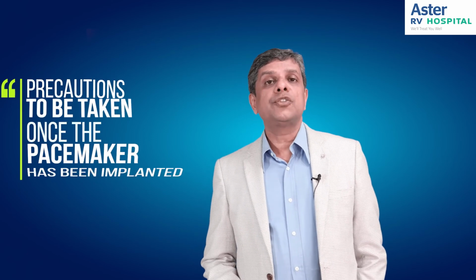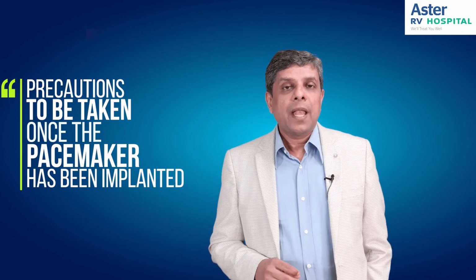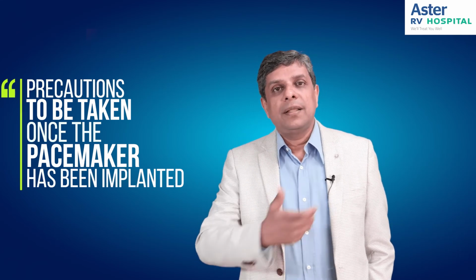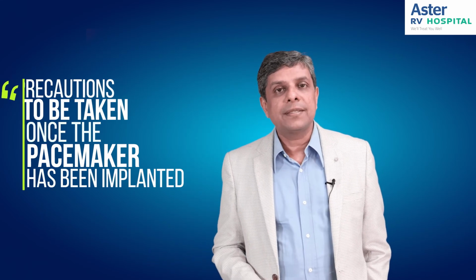What are the precautions to be taken once a pacemaker has been implanted? That is a common question asked, and I would like to address that. An important thing is that when we go into the airport, there is a handheld scanner or a walk-through scanner to look for metal. Pacemakers are not affected by either the handheld scanners or the walk-through scanners.